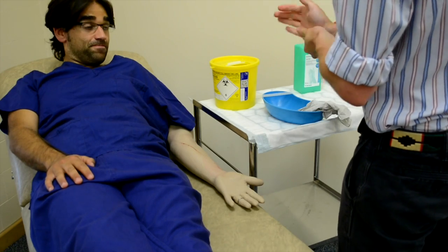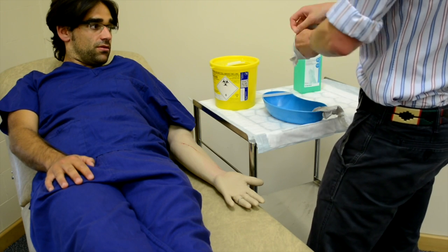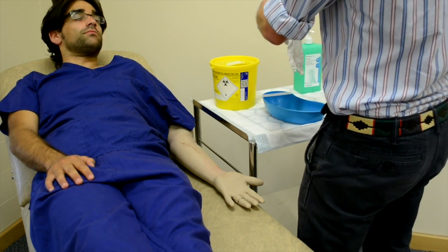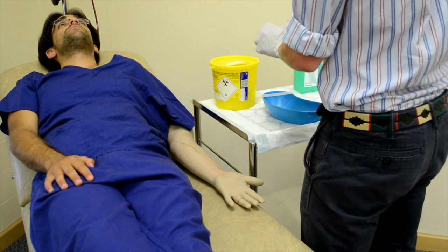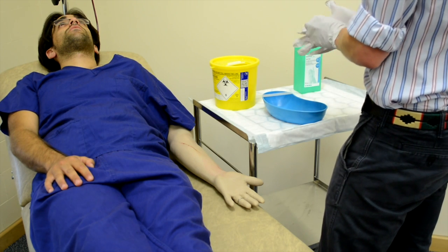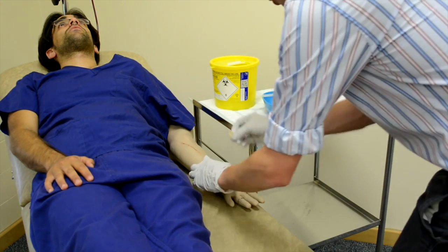So your hand's just in the right position there, Kishan. Is that comfortable for you? That's fine. Okay, just giving my hands a quick wash again. So the first thing I'm going to do is give your wrist a clean, and then I'll tell you when I'm about to start the procedure. Just some cold on your wrist now, Kishan.